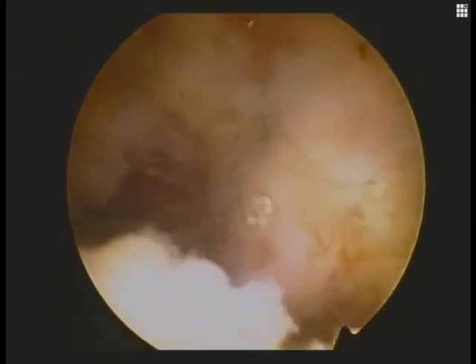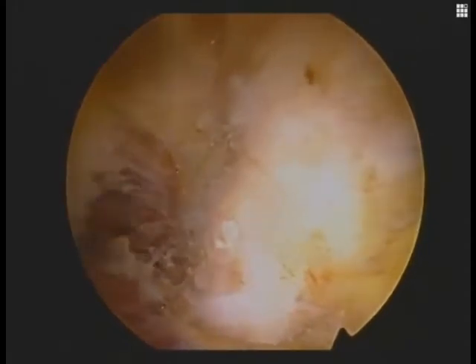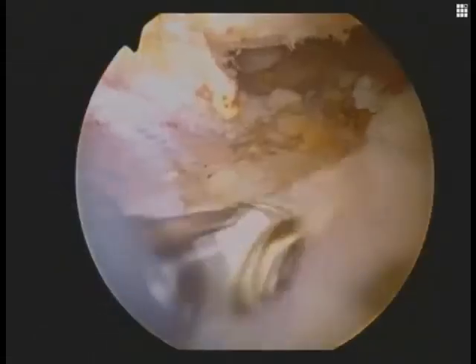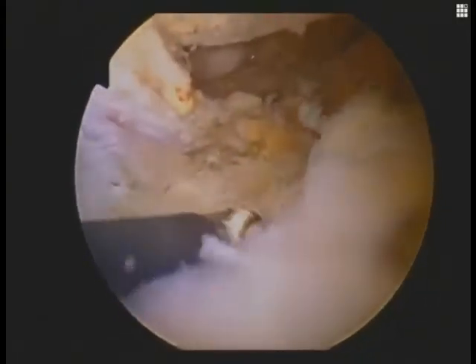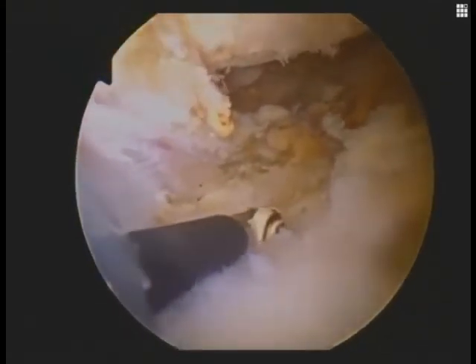We return down to the lateral portal to view and to continue to clean up the bursal tissue underneath the distal clavicle. We'll eventually develop an accessory anterolateral portal. Here we can see in the distance the CA ligament as it abuts indirectly the tip of the soft tissue covered coracoid.